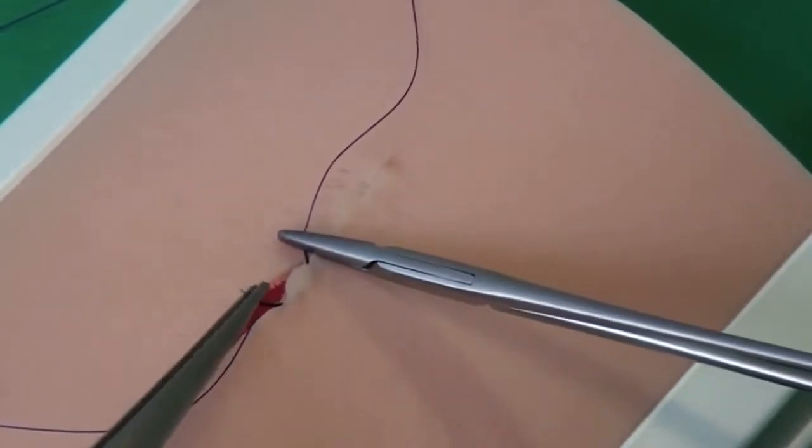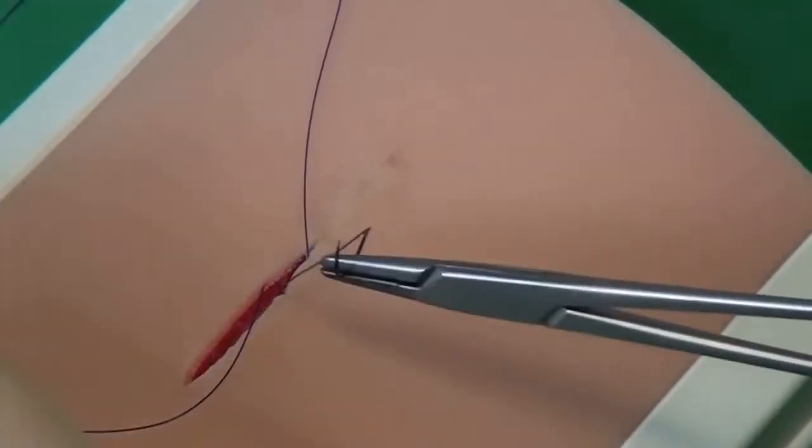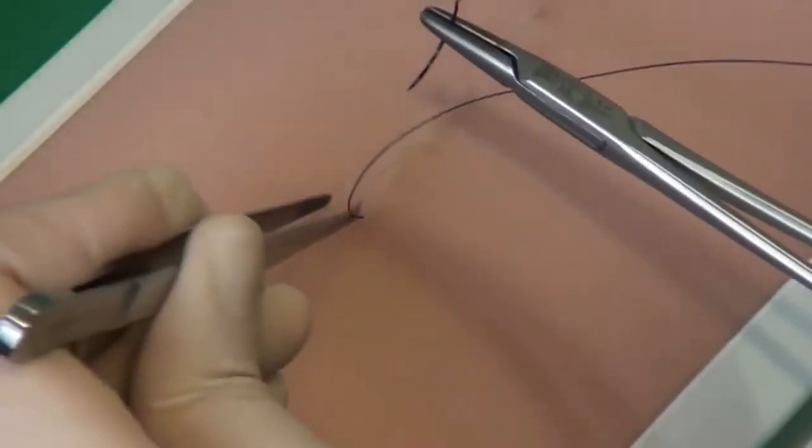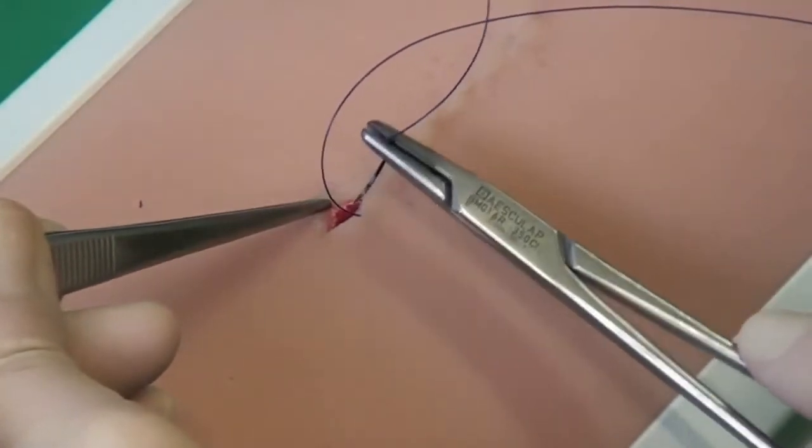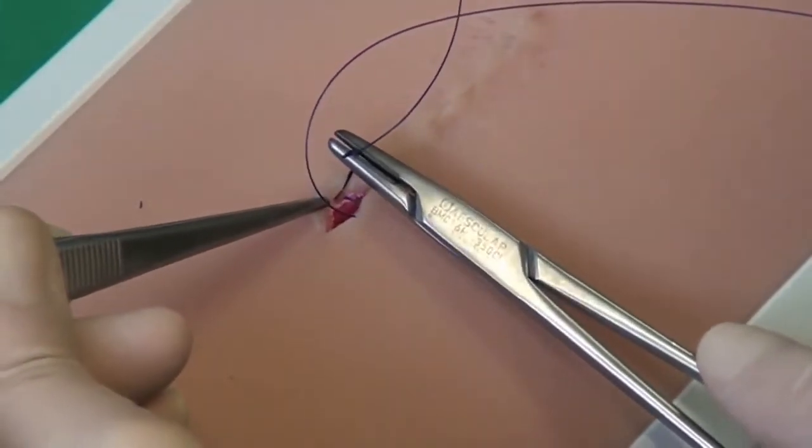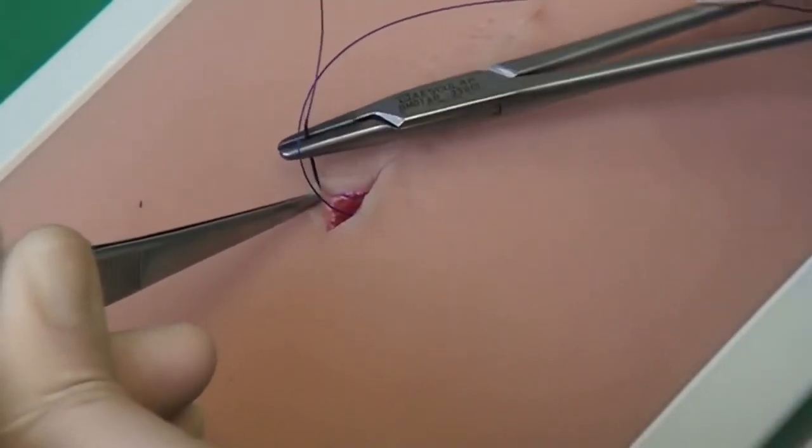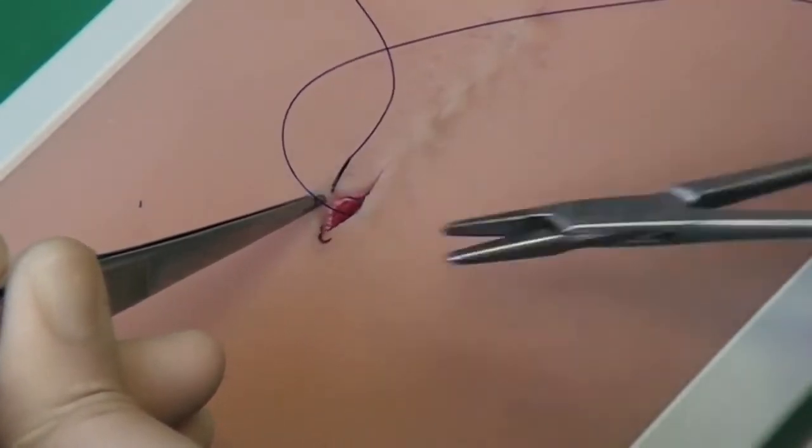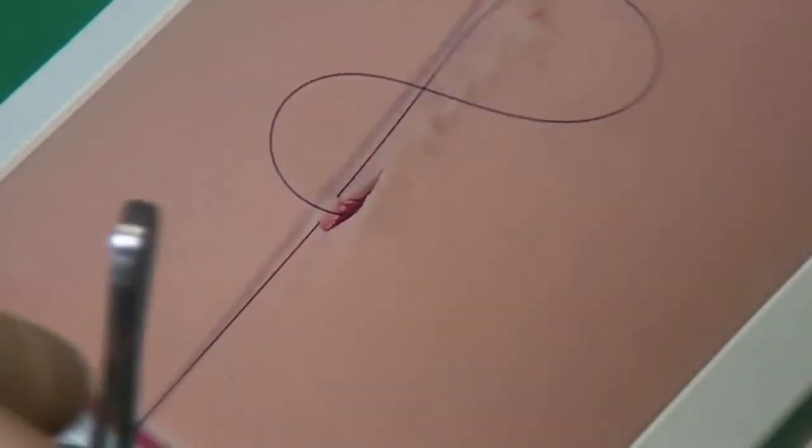Absorbable sutures are routinely used. It is also used as an alternative to single interrupted stitches that are equally purposed to close up wounds. In human medicine, this type of suture is most interesting for aesthetic reasons.